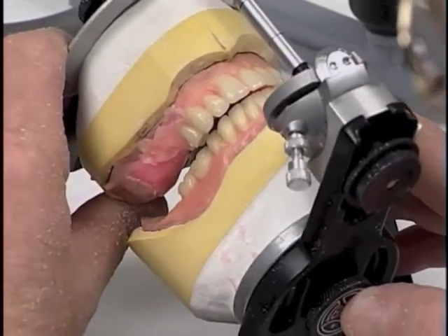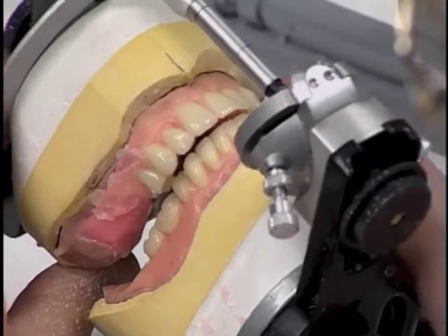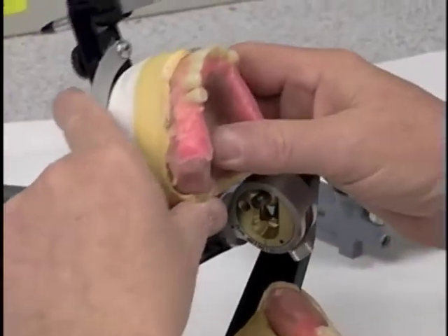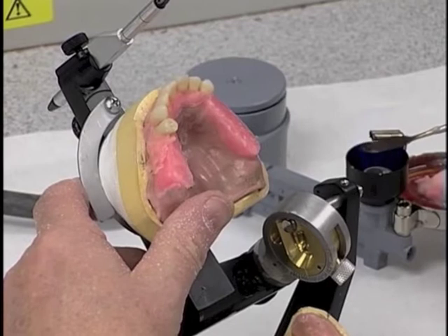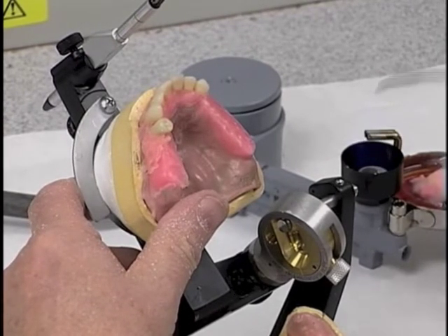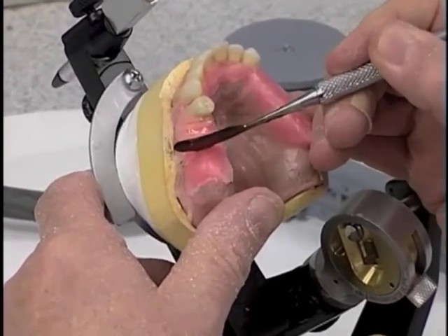This makes for a nice transition. Using non-anatomical teeth, we can use a transition like this. If that were anatomical teeth, those would not arrange like that. We would have to change our anterior arrangement to make it come out right. But with non-anatomical teeth, we can have a little excessive horizontal overlap in that premolar area if it is necessary.